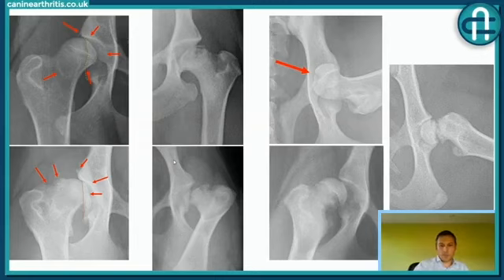Before you carry on, you said the word remodeling. Can you just quickly, briefly explain that? Yes, it's a change in the shape of the joints and the structures in the joints. For example, on that hip, this dog is a young dog, probably around 8-9 months old, and you can see a round head. And then with age, there is a flattening of the head, and you can see that there is a mushroom shape.